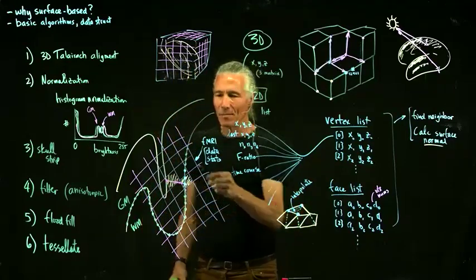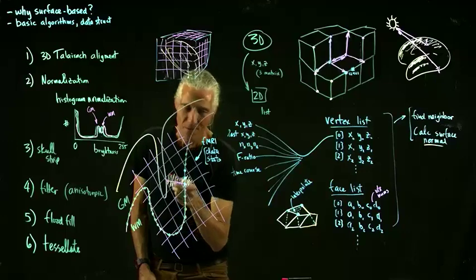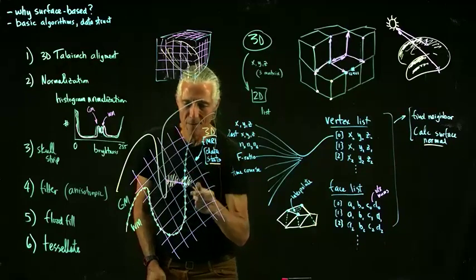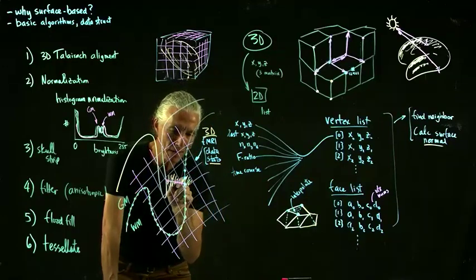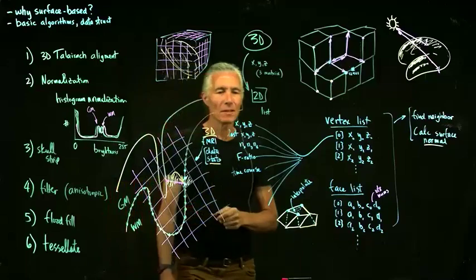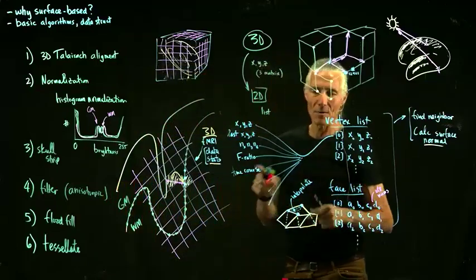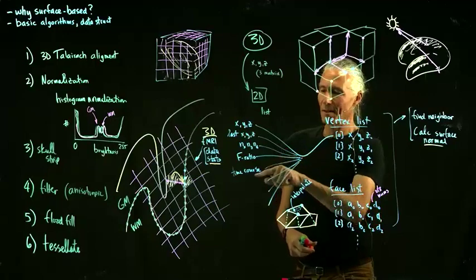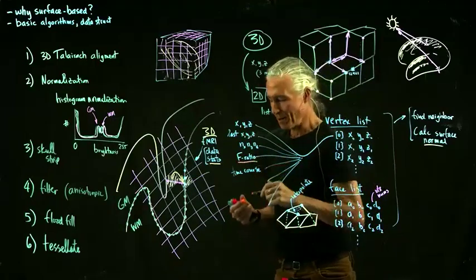And then we could take that stat value. This is 3D fMRI, and we could take that stat value and stick it into this vertex, into this data structure. And so now that vertex, the F ratio will be in there.